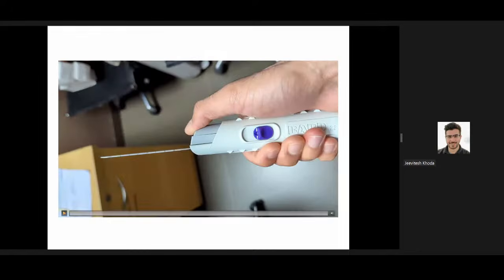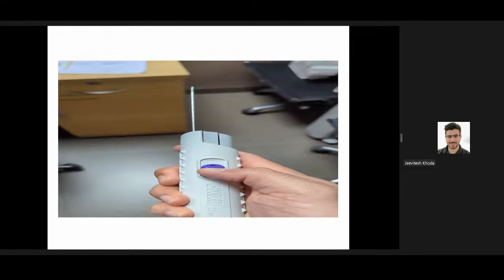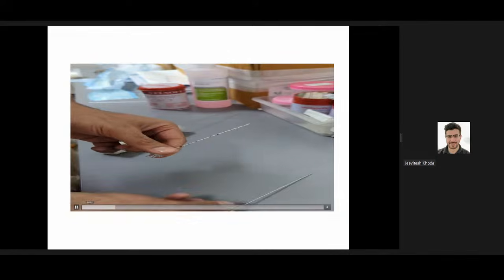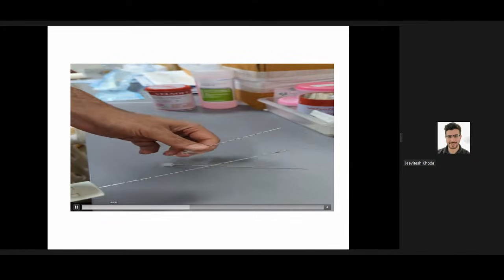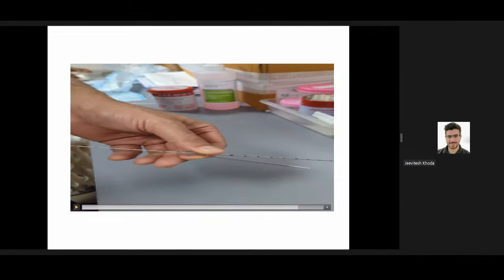So just a small video of how this is loaded. Both the things are loaded, and then a shoot is taken like this. As soon as you take the shoot, the sample is loaded within the loading area which I had shown before. And the coaxial system is like this. If you see, this is the coaxial, the inner stylet is taken out once you reach the lesion. And then you again load the gun as shown previously, insert it into the coaxial, and then you take a shoot. It goes ahead, and it is usually a 2 centimeter shoot, meaning from where the point of your coaxial is.